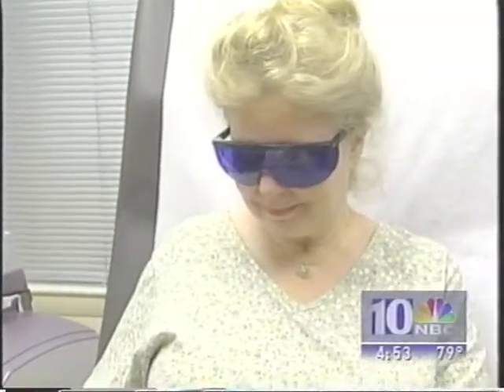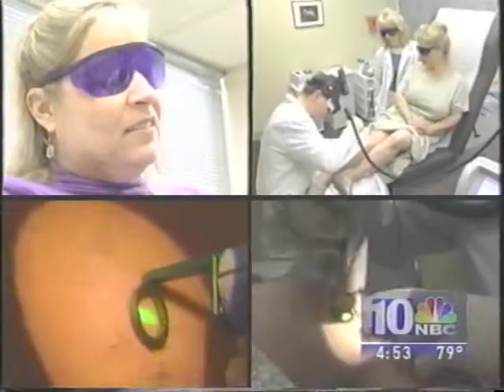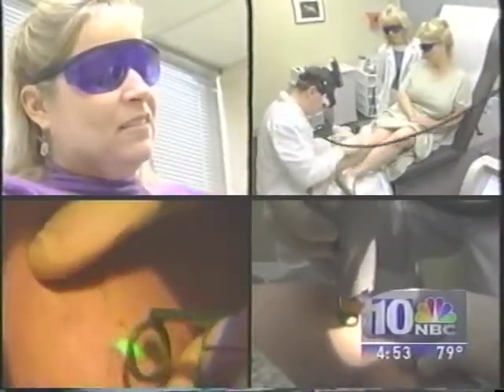Denise McColl loves to wear sexy strappy sandals but thought they made her spider veins too obvious. 'I've had them for years and years and years.' Carol Merritt has them on her face and legs. Everyone hates their spider veins. So they're having them zapped away, hopefully for good.